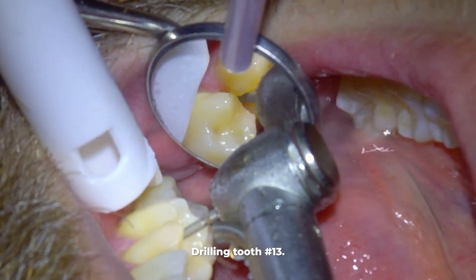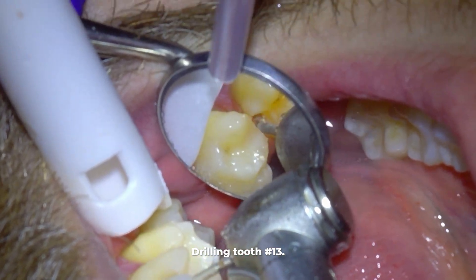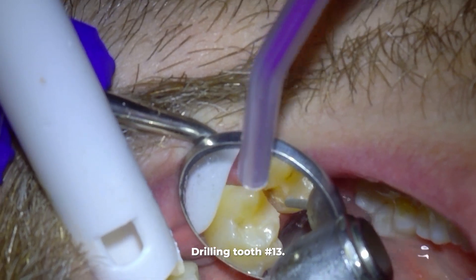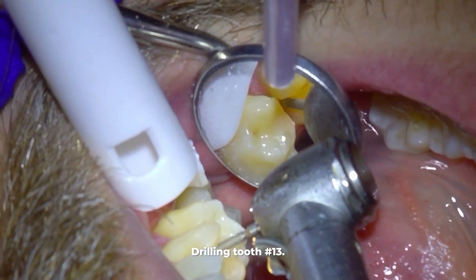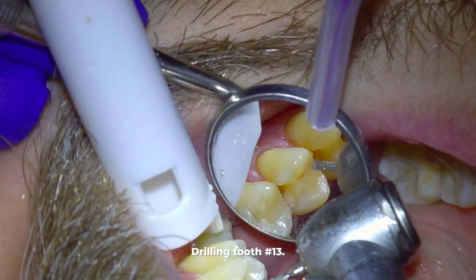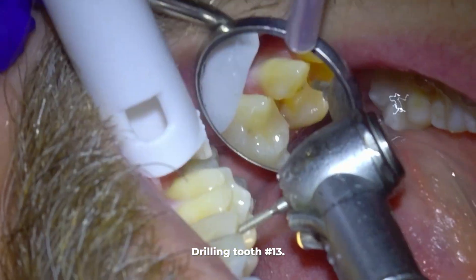My number one rule when drilling on fillings and even crowns is to remove as little of the good tooth structure as possible. The main reason is that the more tooth you drill away, the more likely the tooth will become sensitive. Most of my patients rarely ever complain of sensitivity after a filling.